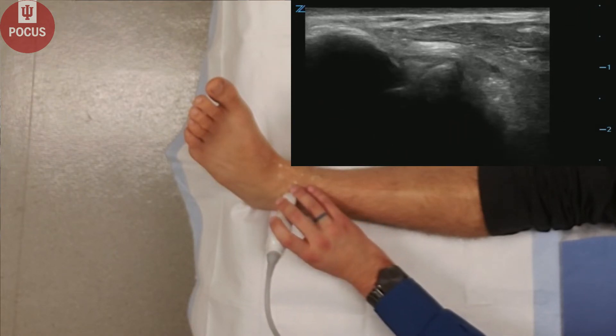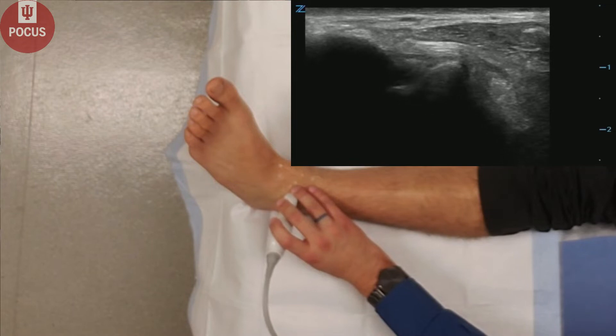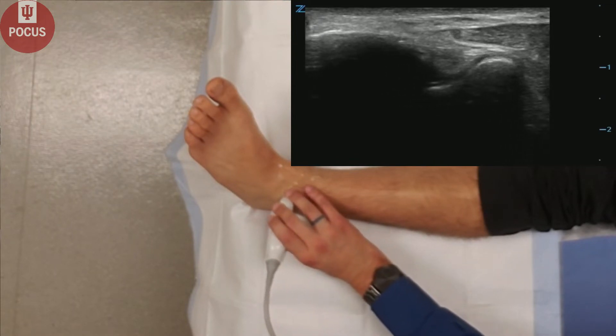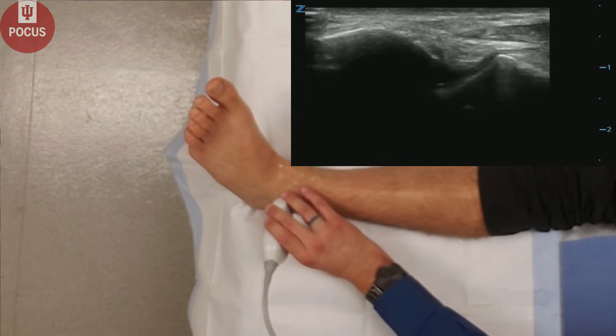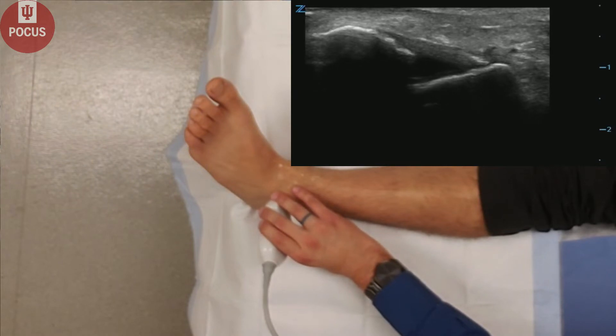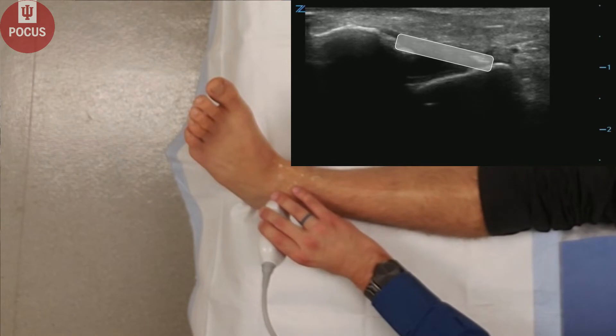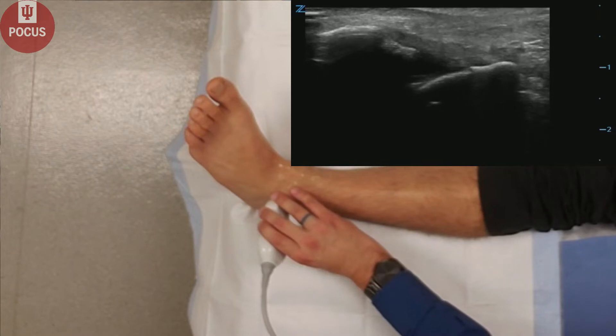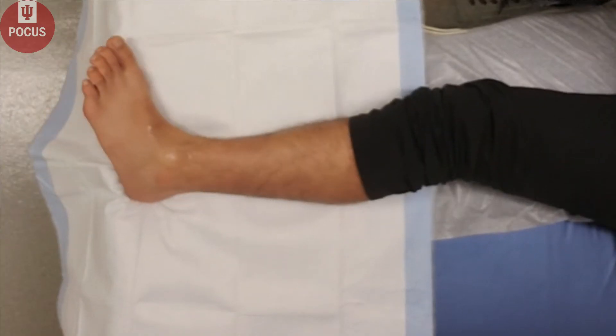Next, we will put the probe on the lateral malleolus, and then slowly rotate the probe — the medial side of the probe more distal — until we can see the anterior talofibular ligament, which you can see right here between the talus and the fibula. This is a common site for injury.